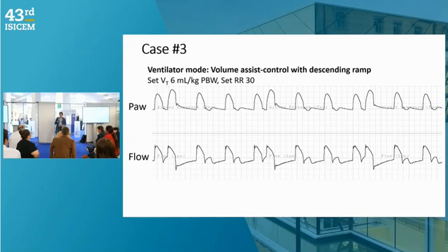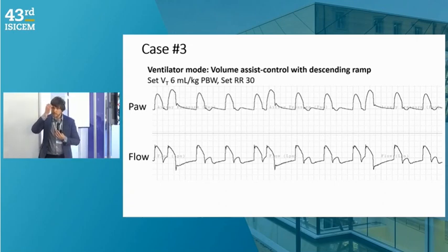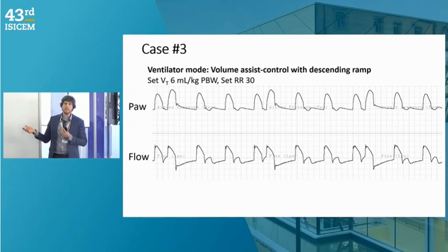That patient? So if you put in an esophageal balloon catheter, which I intentionally left out because not everybody has it, you would encounter very, very high pleural pressures. And so in our EP-Vent 2 trial, for instance, the patient with the highest pleural pressure was at my site, had a pleural pressure of 35. So that patient was on a PEEP of 35. It was one very similar to the patient I described. And he did just fine, wide awake, hemodynamically stable, put him on pressure support, and did a strategy like this to wean him off the ventilator.